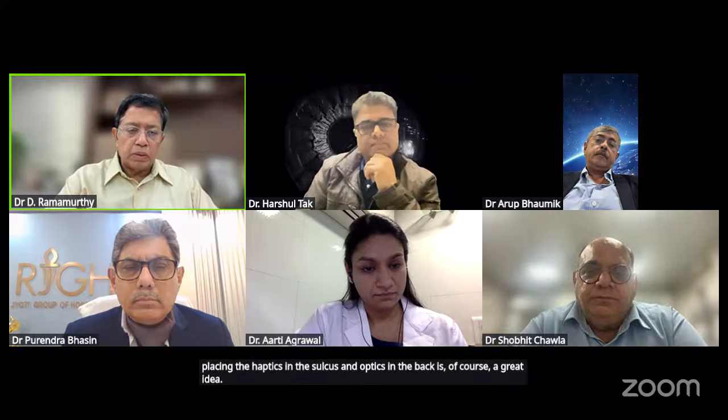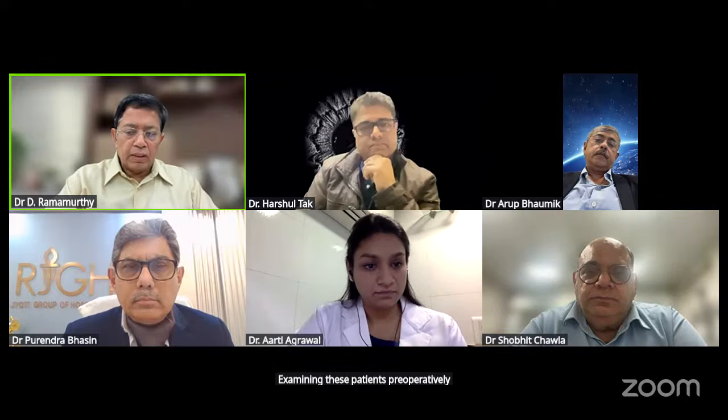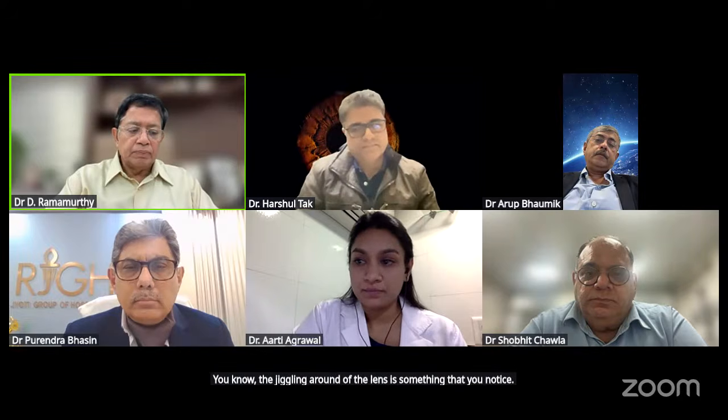Examine these patients preoperatively so that you know the extent of subluxation. Sometimes on the table, it's the jiggling around of the lens that you notice. And I think otherwise everything else was so beautifully covered.